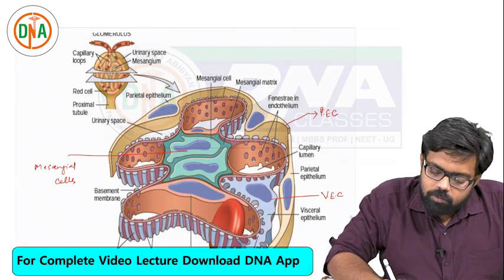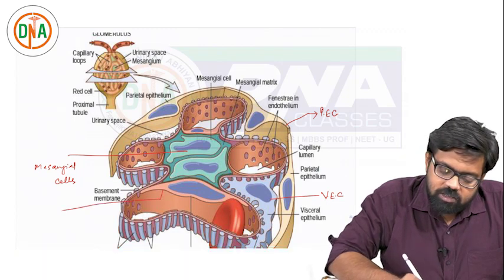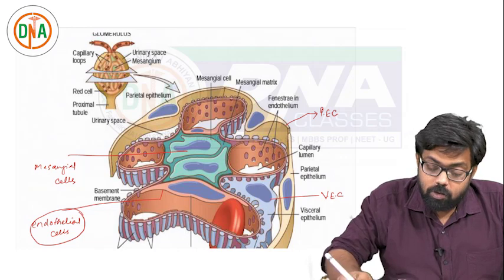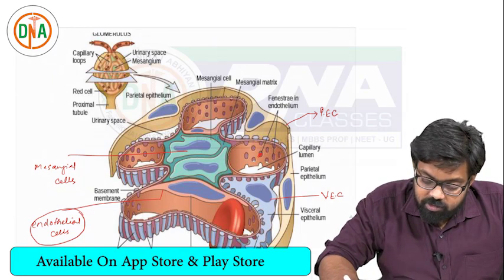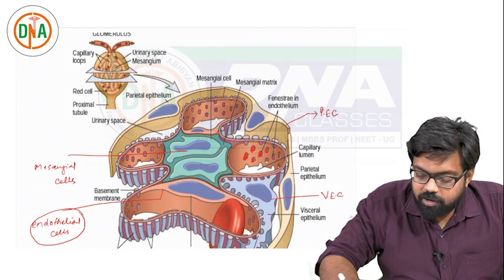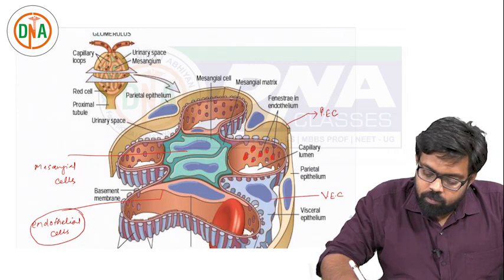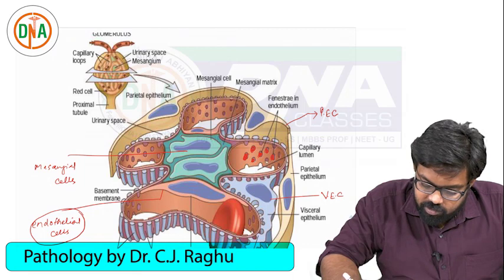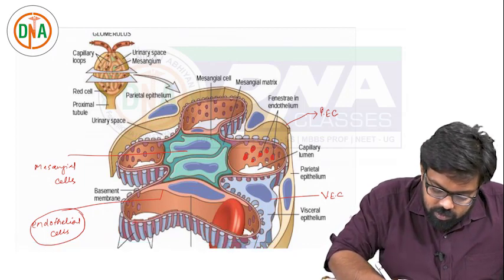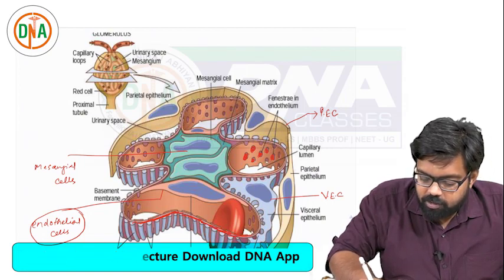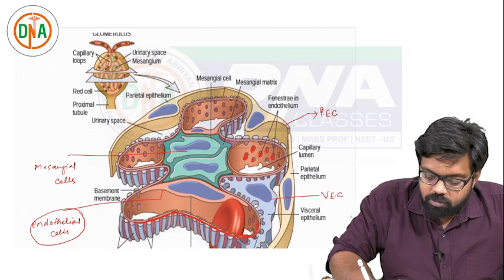These orange colored cells are nothing but the endothelial cells - the fenestrated endothelium. You can also appreciate the fenestrations here. The size of the fenestration is almost 70 to 100 nanometers. And in between, there is a maroon colored linear structure - this is nothing but the glomerular basement membrane. So this is all about the structure of the glomerulus.